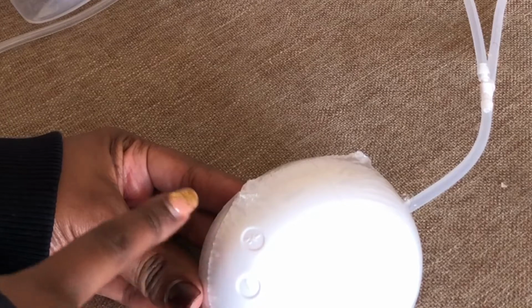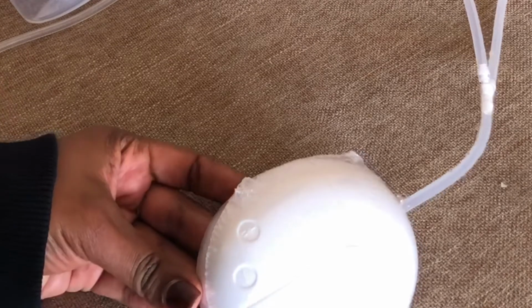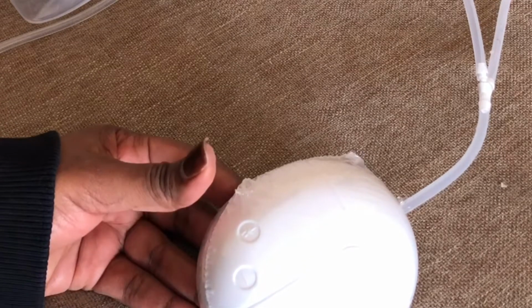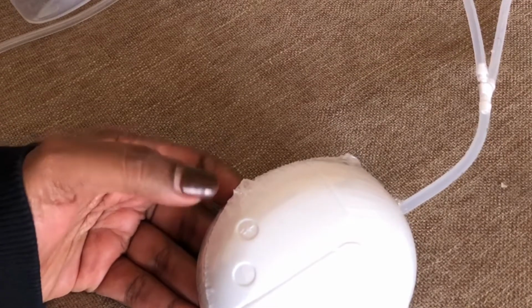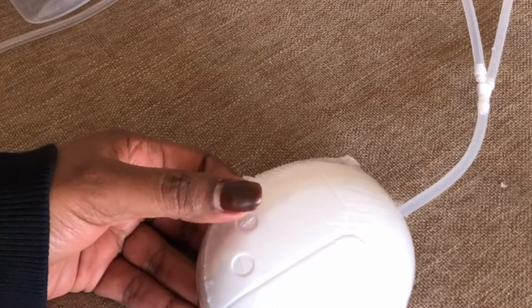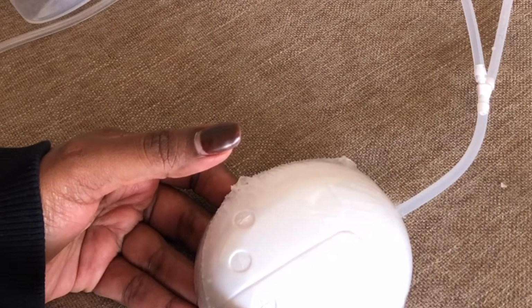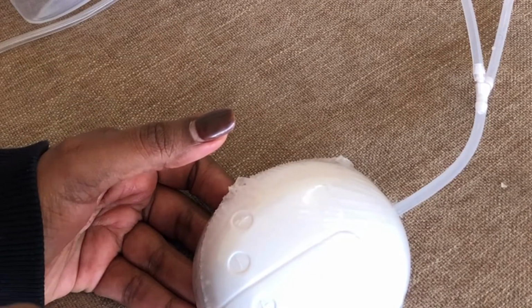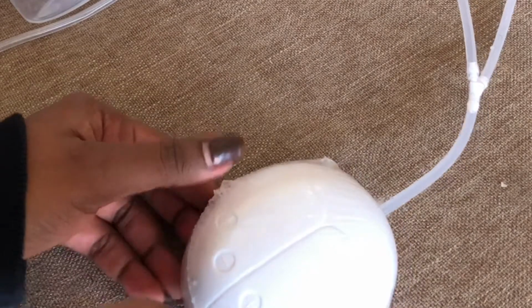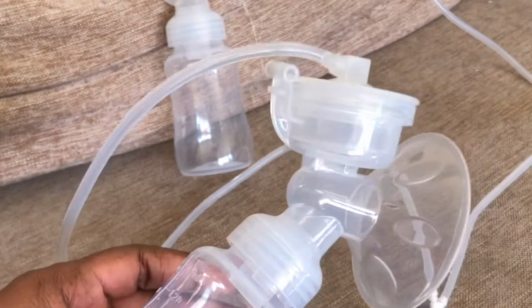So stimulation is just the feeling of stimulating milk to come out. Just the feeling of naturally, like how the baby feeds on you. So when you press there, it should be blue in color. So this plus is for suction. Suction is how the baby sucks on your nipple. So that is the same feeling that you should get, and this is how it is.